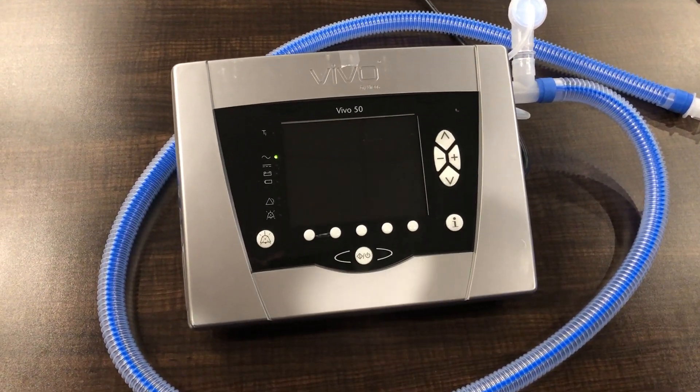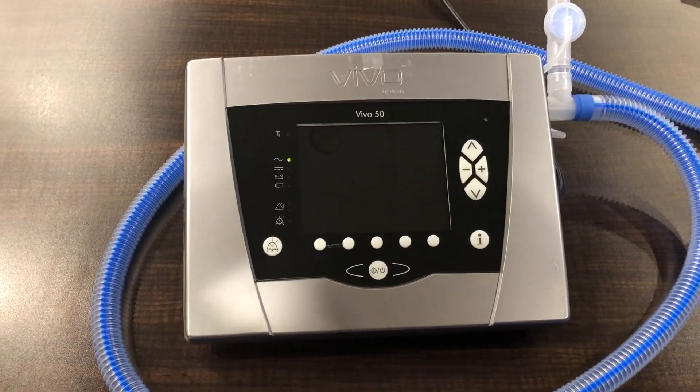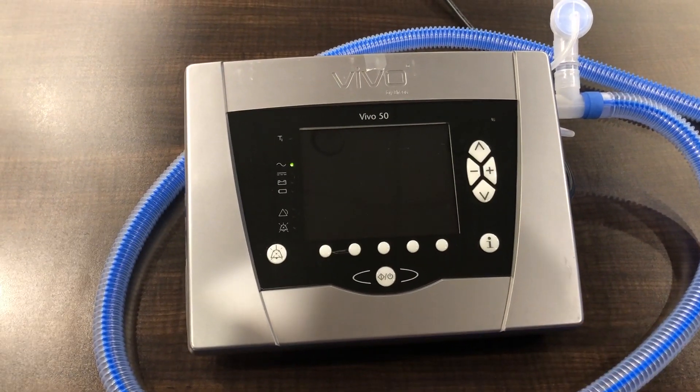This is Jerome Cambry with ViMed. Today we want to show you how to perform inverse ratio ventilation on the Vivo 50.